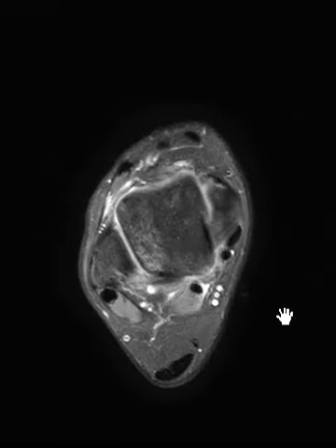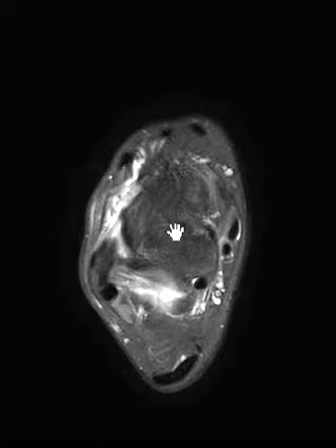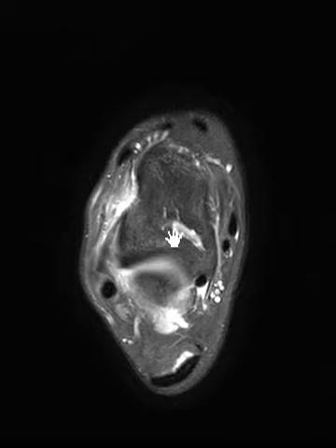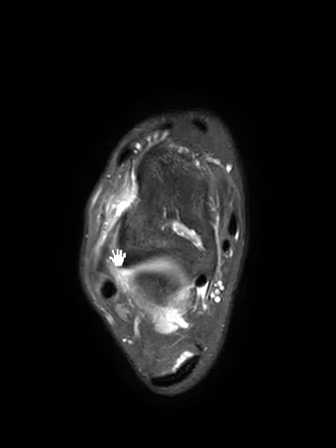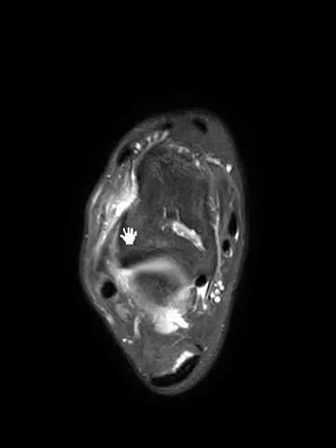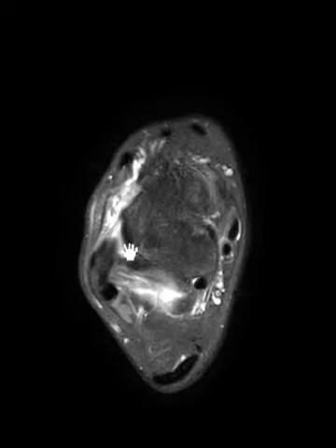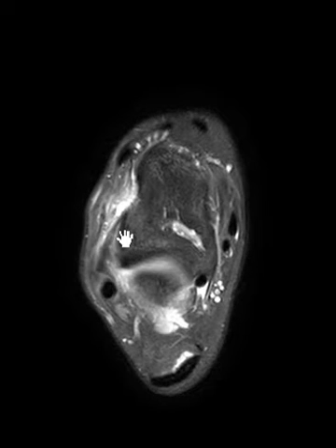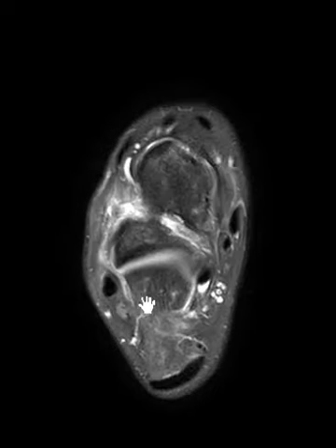We look here on the lateral side and we see fluid out here in the anterolateral gutter area. We're looking for the anterior talofibular ligament to confirm it's torn, but instead we see a little linear band that comes off the fibula and goes to the talus. This is the anterior talofibular ligament — it's not completely ruptured — and this fluid is fairly prominent, more than you'd expect with an intact ATFL.